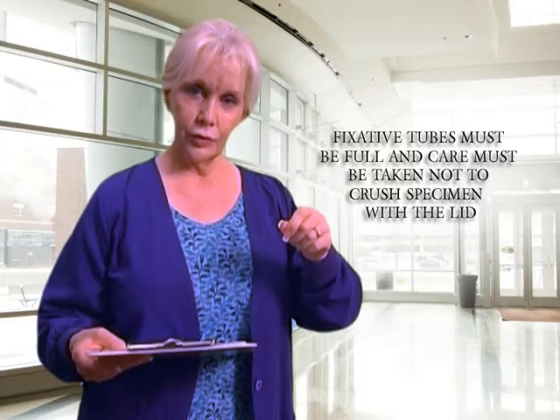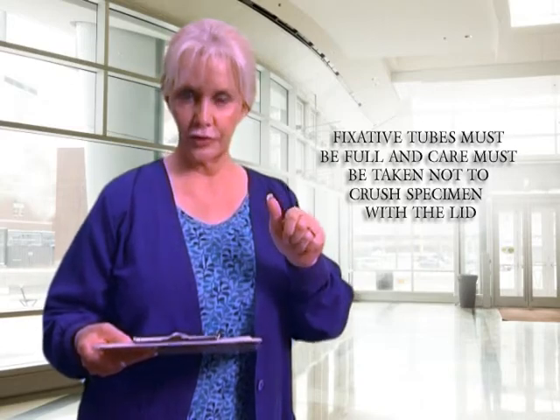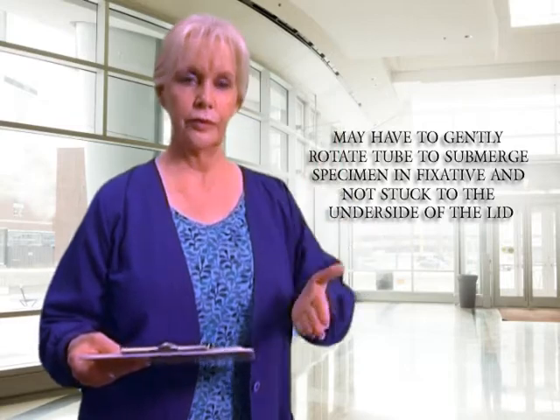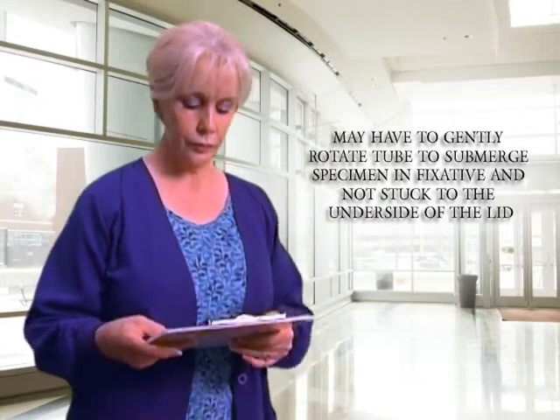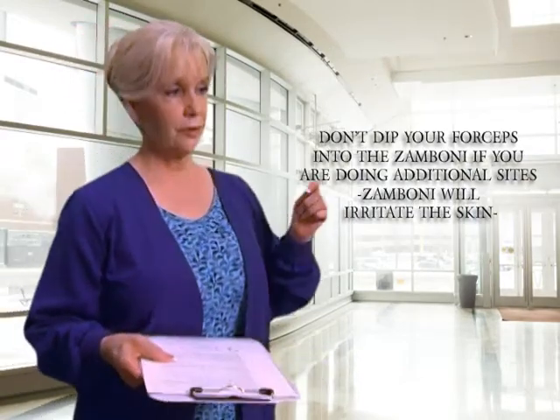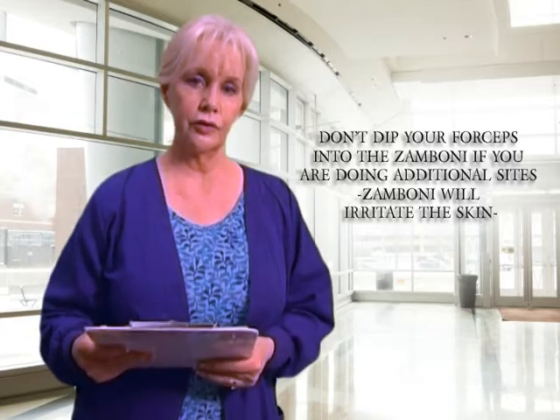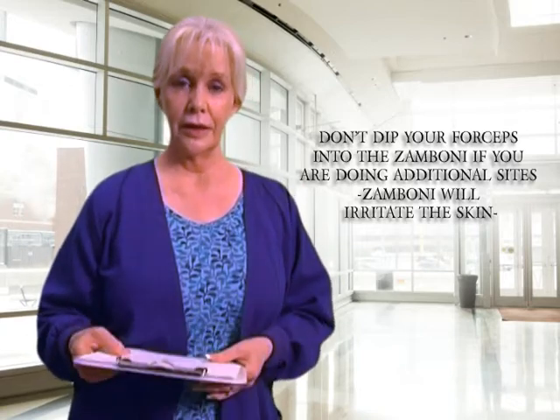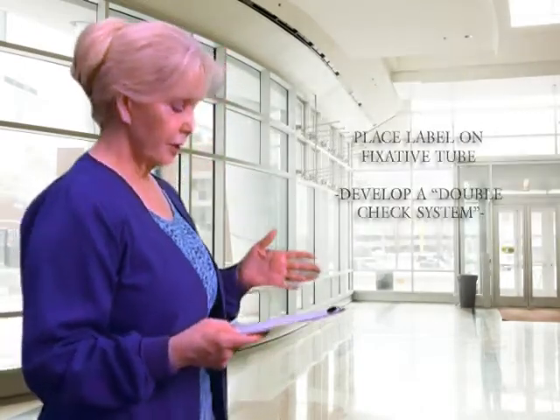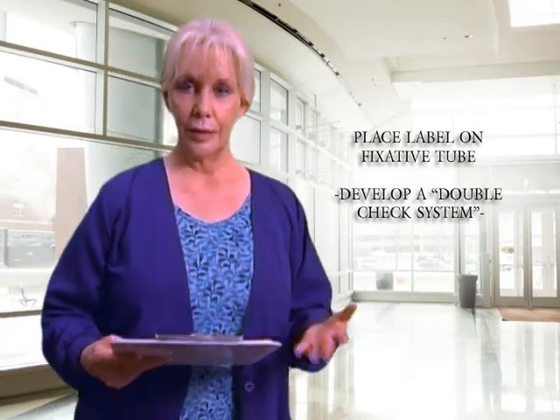Drop the biopsy into the Zamboni fixative tube. The Zamboni tube is packaged very full — that's intentional — so make sure it drops in properly. When screwing the cap on, be careful not to crush the specimen. Rotate the tube a time or two and you'll see the specimen float to the bottom. Also be careful not to touch your forceps into the Zamboni, especially if you're going on to do another specimen, as it can irritate the skin.